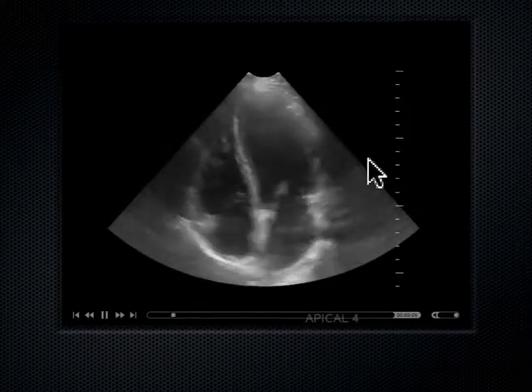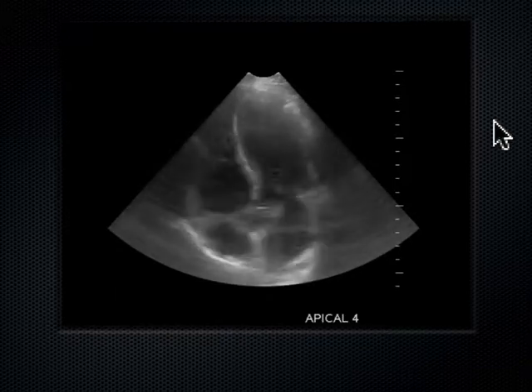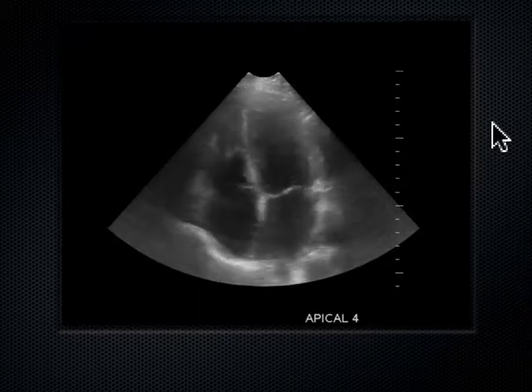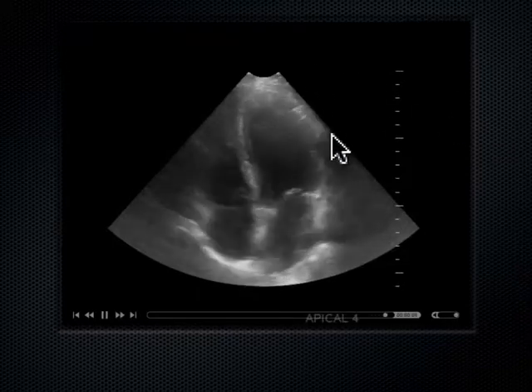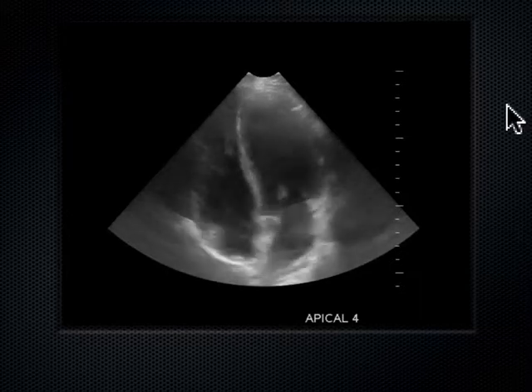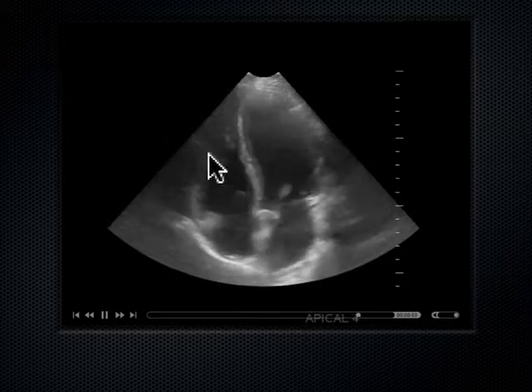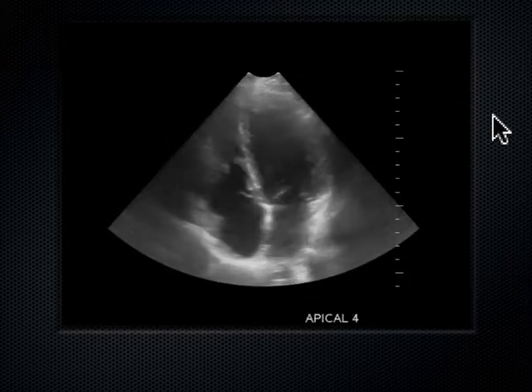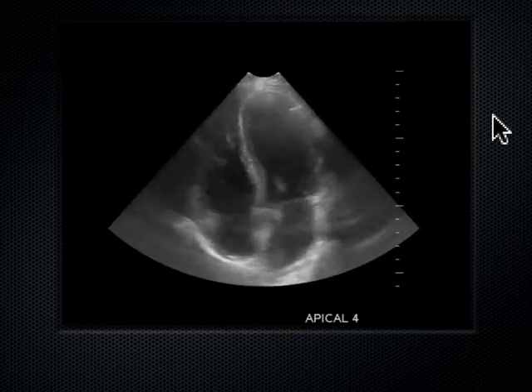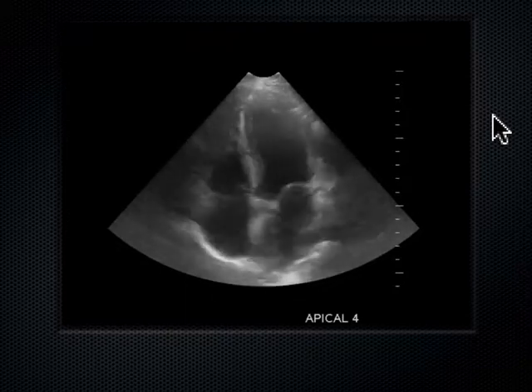I wouldn't say it's extra pretty. I would say it's not too ugly or fuzzy. It's probably about the average view that you see. Because remember, there's so much lung around all this stuff, and lung air is the enemy of ultrasound. You get some scatter there. So that's why sometimes they don't look that crisp. And the larger the lung fields these patients have, so the patients who have COPD or expanded lung fields, you're going to struggle extra hard trying to get these views.